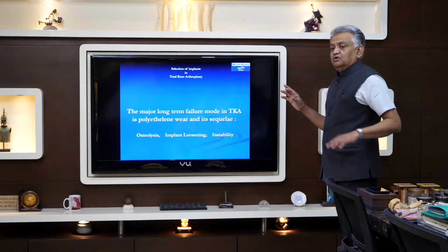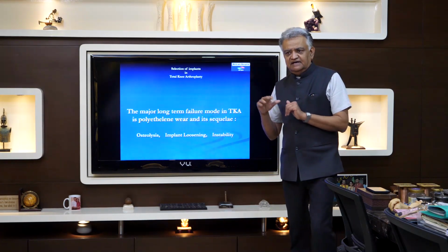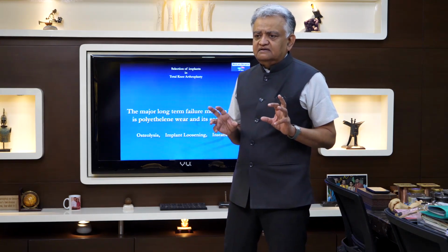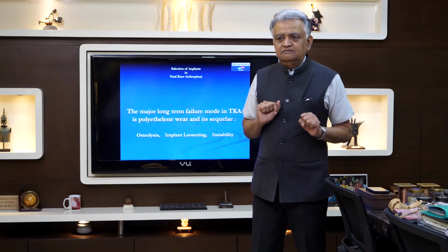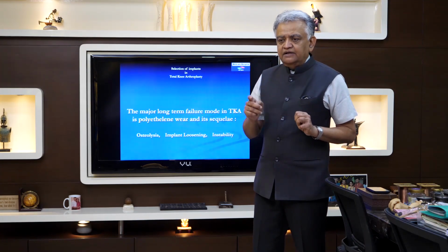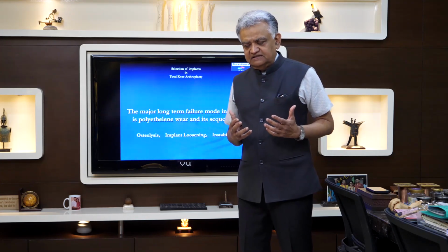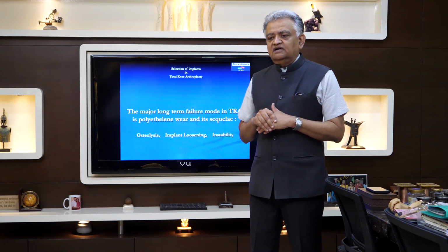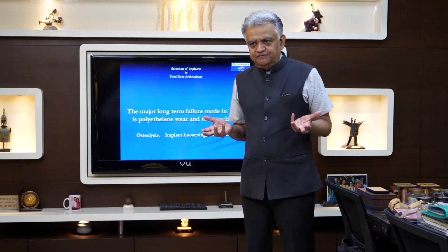So, I am now introducing a lateral subject. Whilst this is about selection of implants, an implant is nothing without understanding what the plastic insert is all about. And as far as the plastic insert is concerned, you need to understand the one important thing about plastic inserts: they are not like metal, so they can fail. They are obviously softer materials compared to metals.